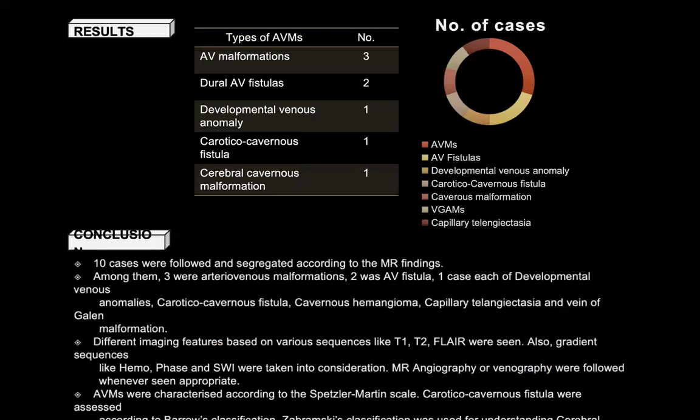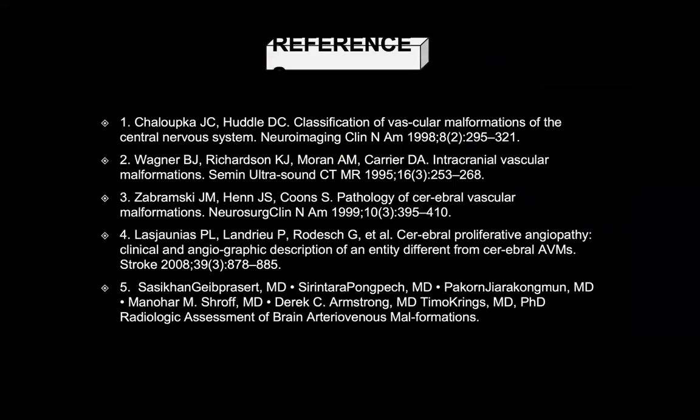This is the summary of the cases that we have seen, with the results and conclusion of the study as follows. Thank you.